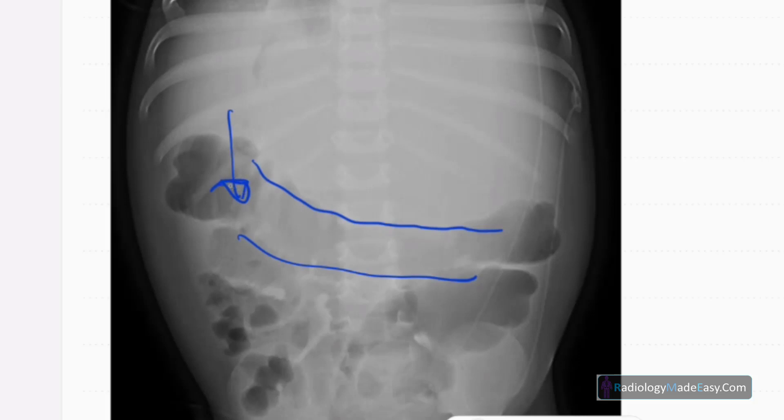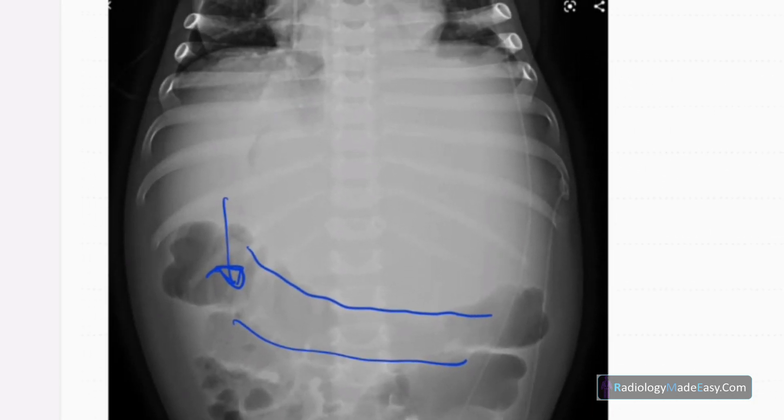So it is inferior displacement there, and you can see an opacity, ill-defined opacity in the epigastric, umbilical, and left hypochondriac region. So it's a homogeneous opacity.